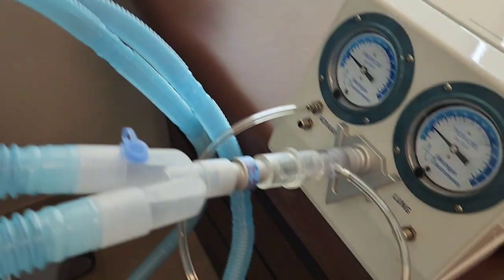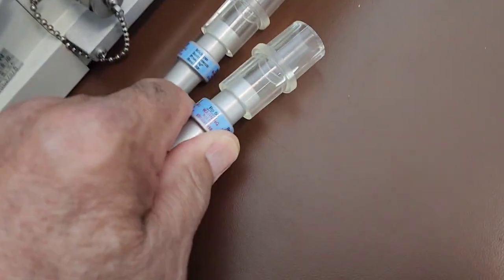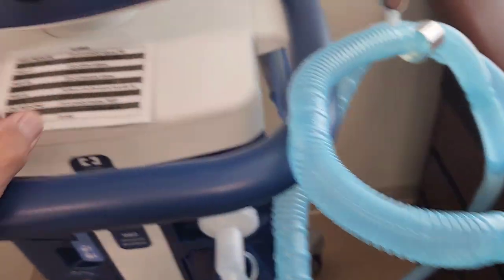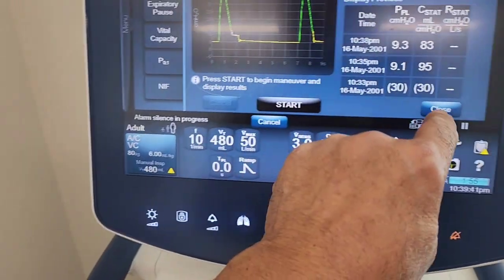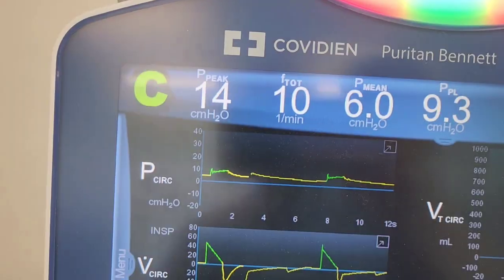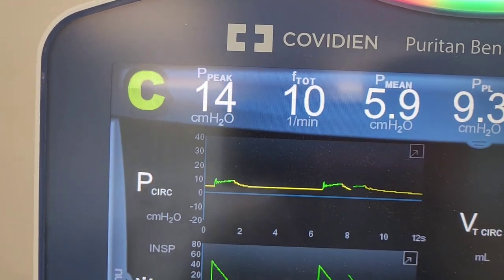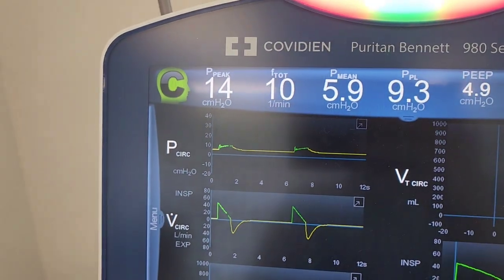I'm going to take this resistor off here, the 50, and let's see what. Hang on. Silence. Okay, let's go back. I just put back to standard resistance. Close. So now let's look at, and remember, pressure increased when we added resistance. It was at 31 with that number 50 resistor on there. So that changed, pressure changed.